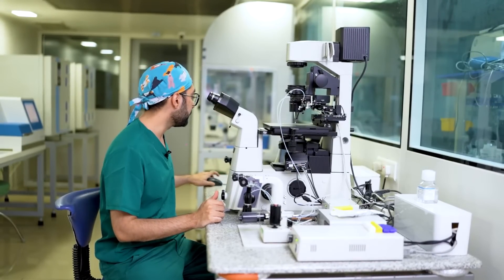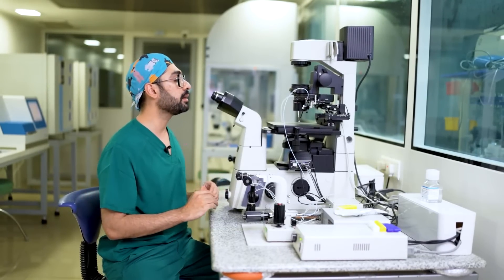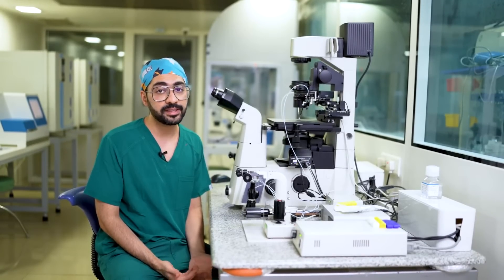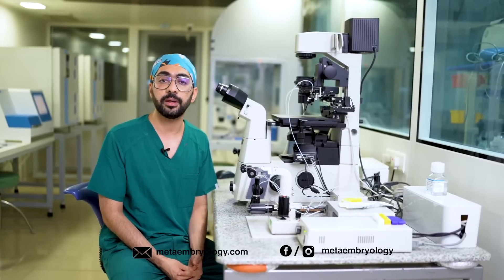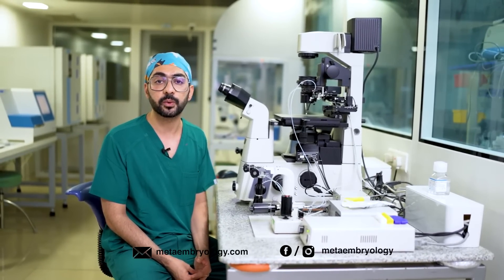Once you achieve both needles being parallel, that's where you stop the alignment and the next step would be to move on for ICSI. So that's basically how you would set up a micromanipulator. If you have any more questions, you can ping me on my email at metaembryology.com and I'll be happy to answer your queries.